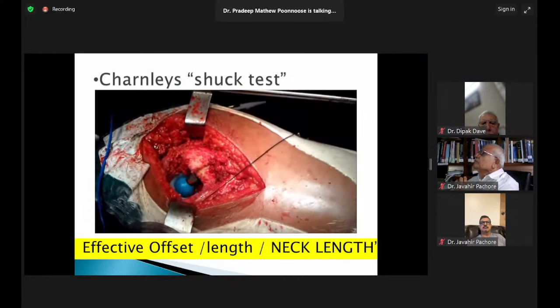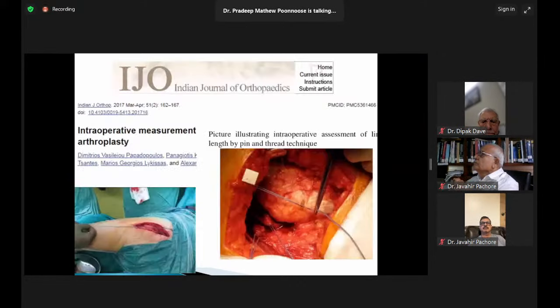If it's a height problem, then you can probably sink in the stem. Now, you also have a variation of this, which is the stitch method. So you can see that it's stitched out there at the top. So it's not like a fixed point. Some people don't like putting it on the skin, so what they do instead is they put the stitch on that post, right?